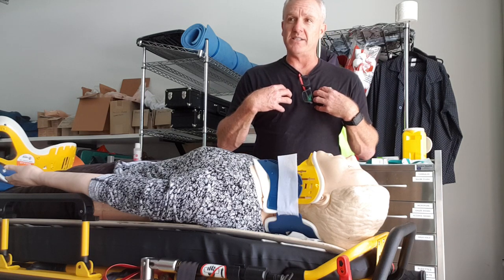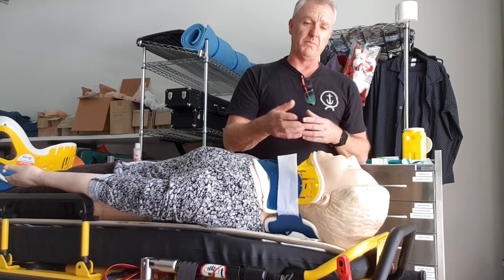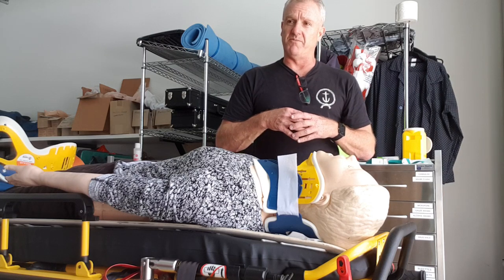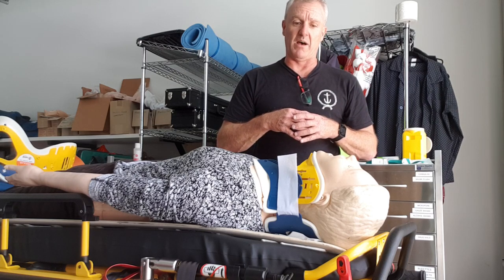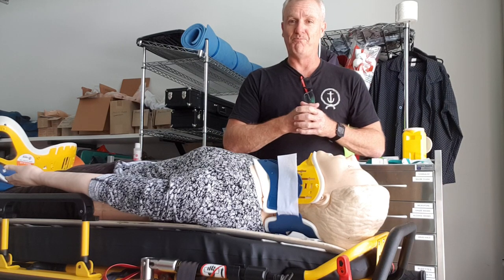That's how I do it. I think you'll find most on-road paramedics, particularly in New South Wales, are probably doing it this way. Something for you guys to consider in terms of the choice of method that you take when putting on a cervical collar. All right. Good job. Thanks.